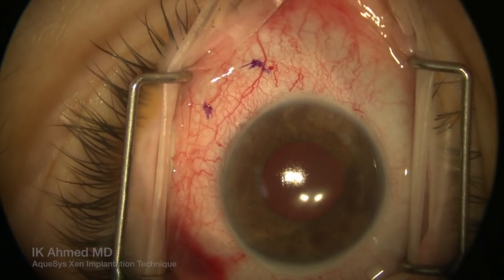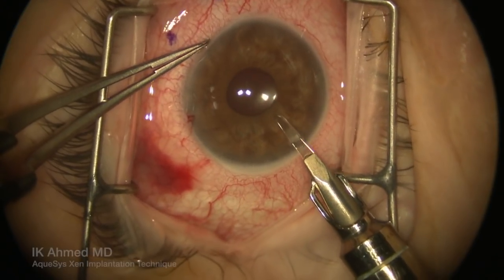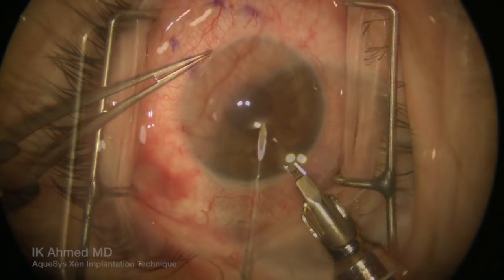This is in the supranasal quadrant, which allows us to access the anterior chamber through an infrotemporal incision, made about a millimeter into cornea.